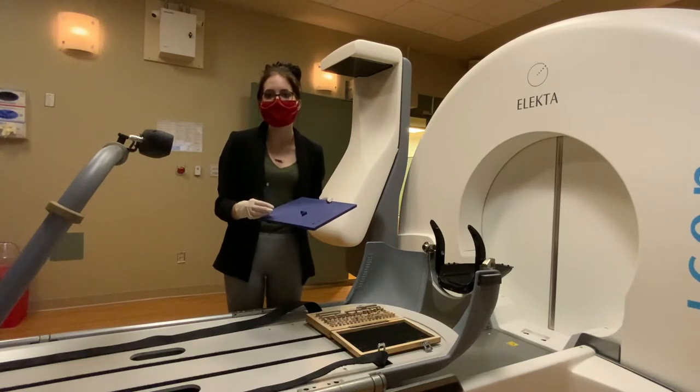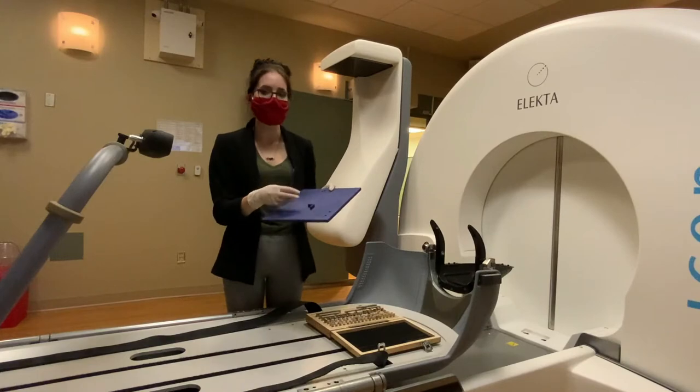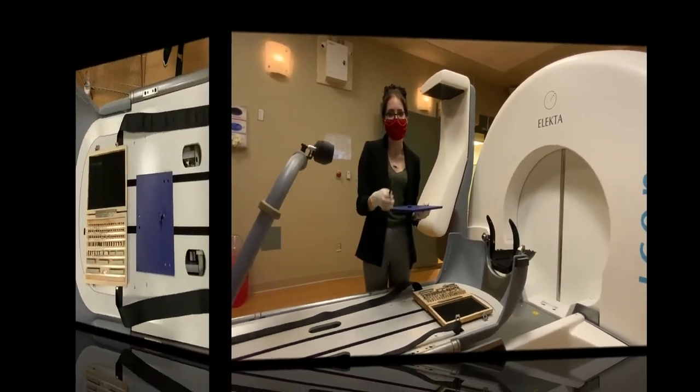We designed an inexpensive, easy-to-use QA device that fits snugly on the mask frame and can be used to perform quick daily checks of the camera. The device consists of a stage, a raised corner, and a post with a reflective marker.